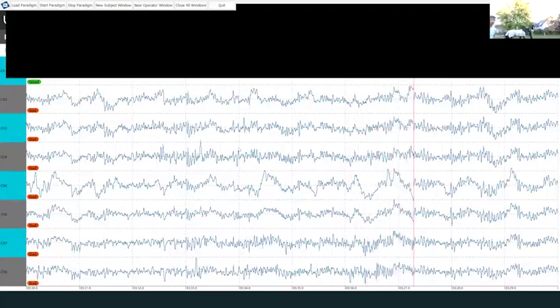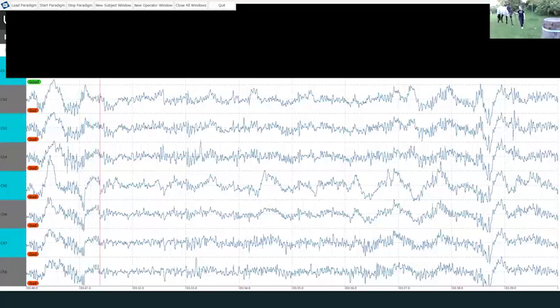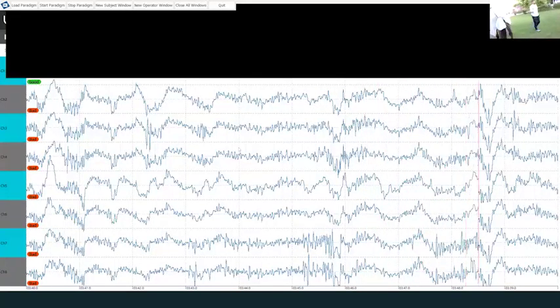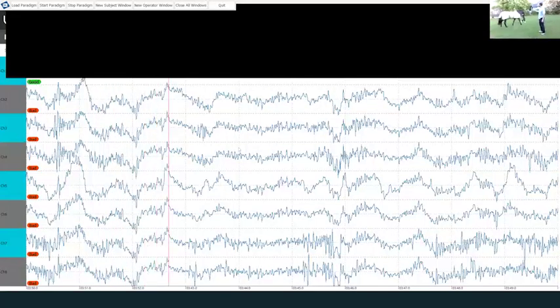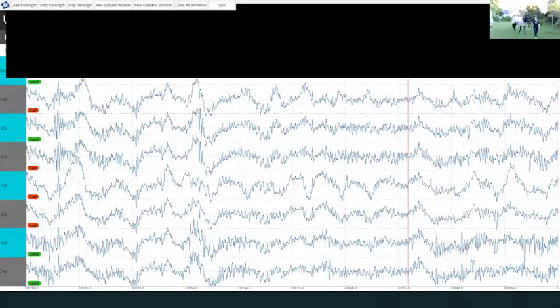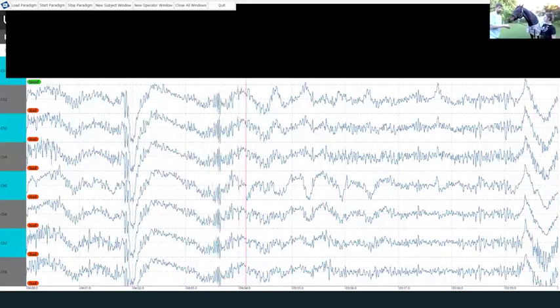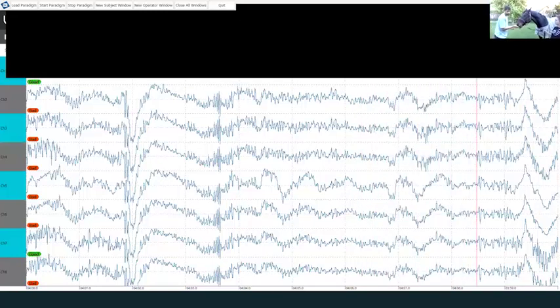We are actually outside, so that's not the best case for Bluetooth Low Energy because we don't have a lot of reflection on walls, so we prefer it inside. But still, you can do all the measurements outside, freely moving, and this is very interesting because you don't need to limit their normal behavior or sedate animals. And yeah, that's the signal. We also see the movements and biting.